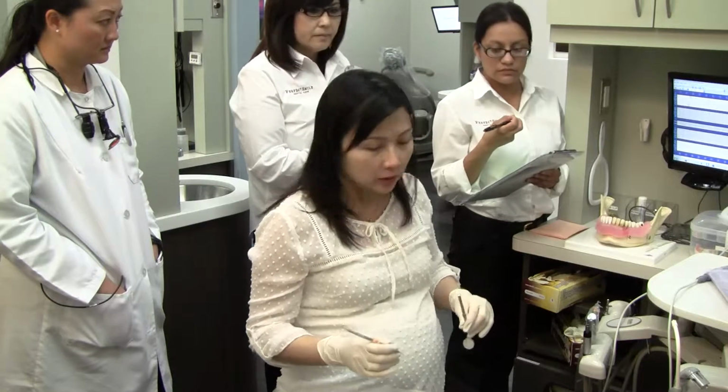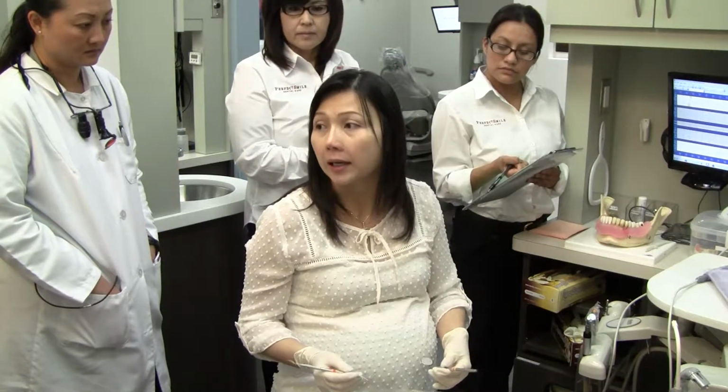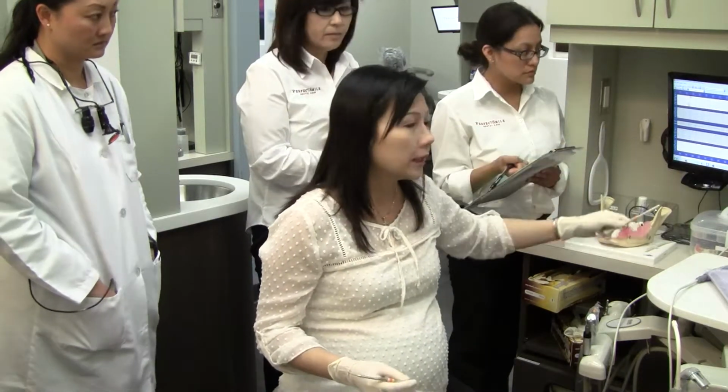Alright. So I tell the patient, I'm just gonna take some numbers, read out some numbers. You'll hear 1, 2, or 3, those are healthy gum. Anything higher, 4 or 5 is a sign of gum disease. And then I'll just read out the numbers. And Brittany will start entering that in.